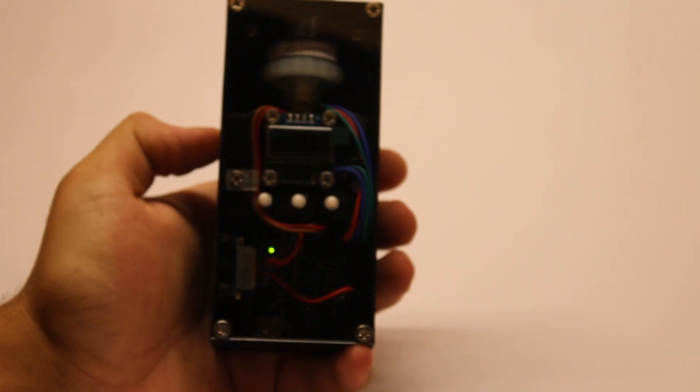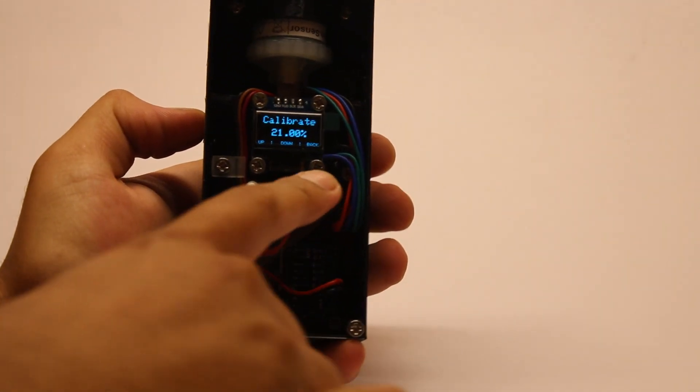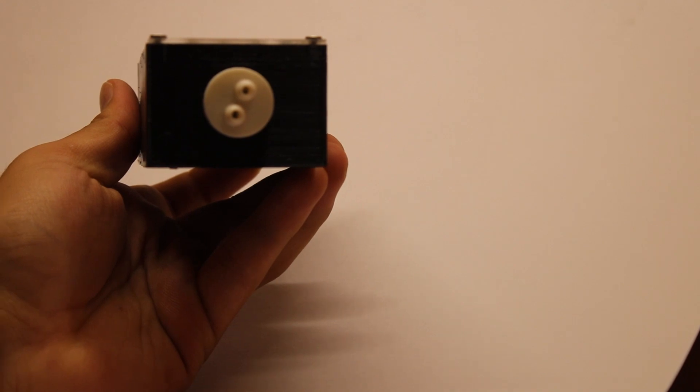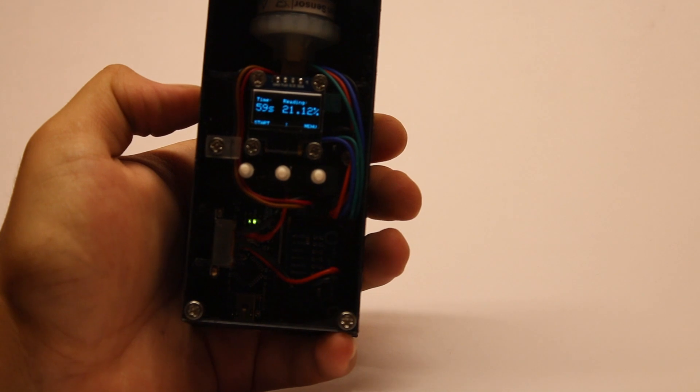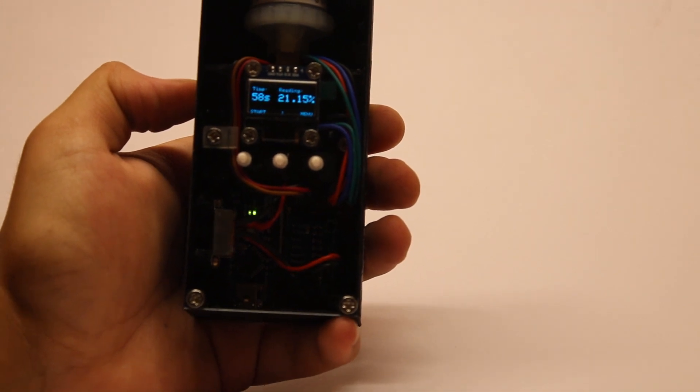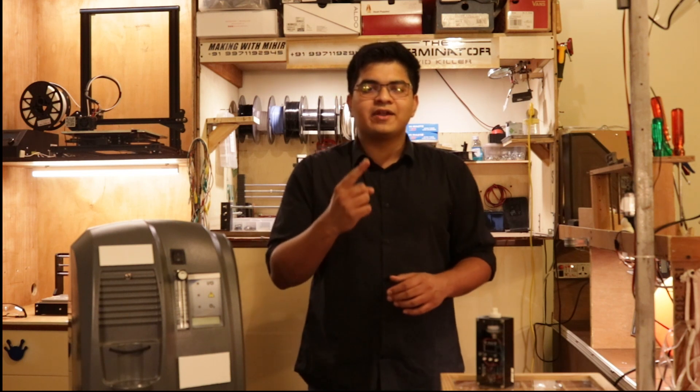How do you use it? Power on the sensor, set the expected ambient air oxygen concentration, plug one end of your tube to the sensor and the other end to the output of the concentrator, and start the one-minute timer. According to the datasheet, the sensor only takes 12 seconds to reach its final value. But to test conservatively, we wait one minute for each reading at each flow rate. It's that easy.